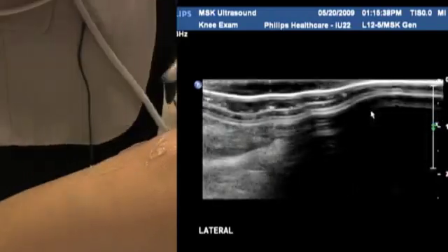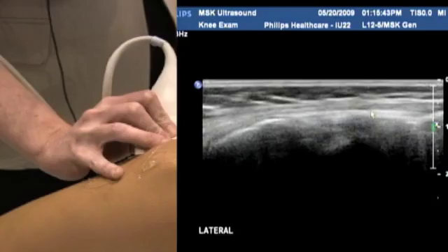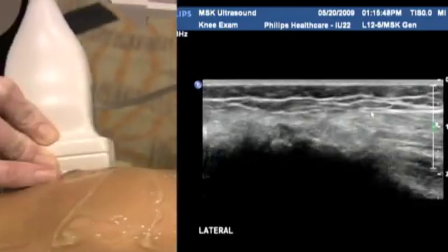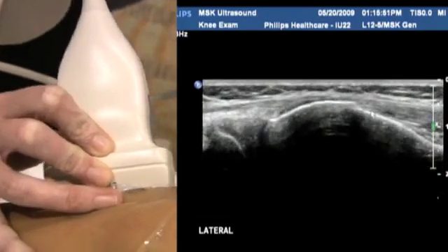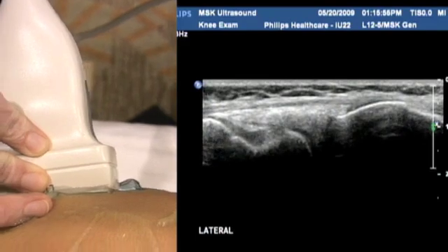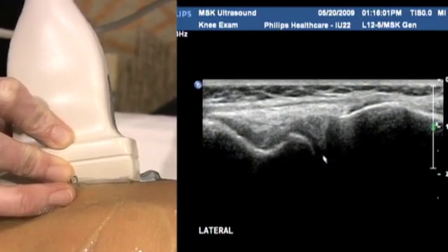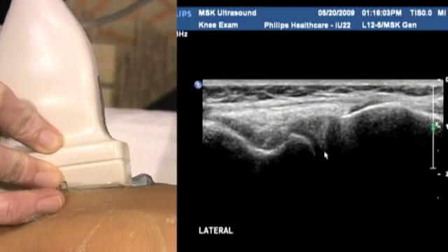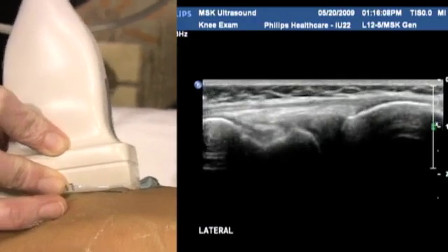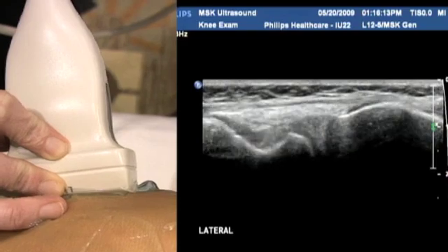So on we go laterally now. At the level of the knee joint itself, you see proximal up this way, distal down this way, proximal tibia. In the middle, just here, again being very wary of anisotropy, you'll see an echogenic triangle just here, if we can make that out. And that's the lateral meniscus, that's the padding of the joint laterally. It's quite a common place, particularly in athletes, to get tearing along there.